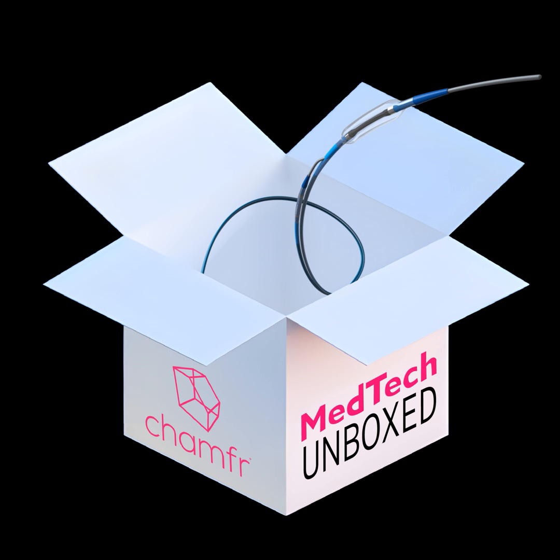I'm relatively new to the world of catheter design. My background, like I said, is mechanical engineering and design engineering in medical devices, but I only came to catheters about 2 years ago. When I started working in catheters, I realized that there aren't a lot of good tools for designing these things. It's so heavily tribal knowledge.